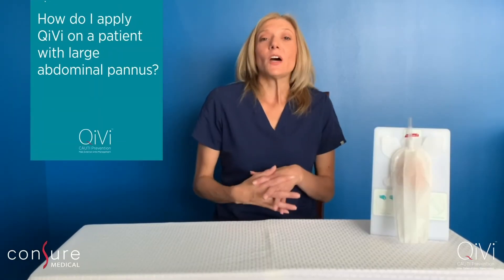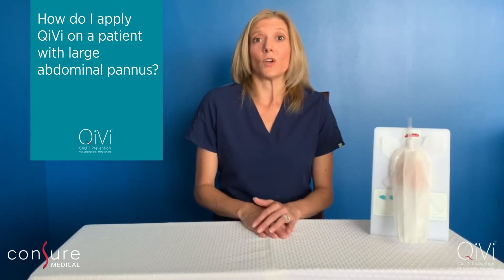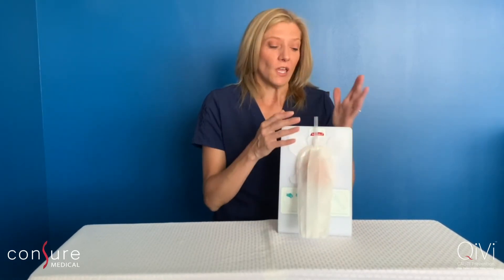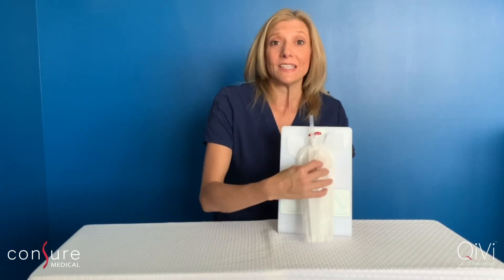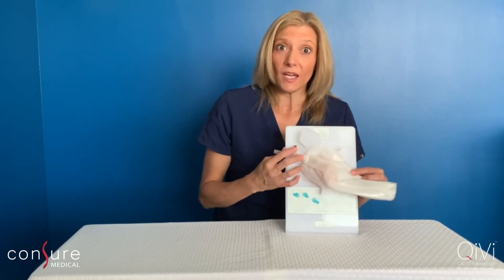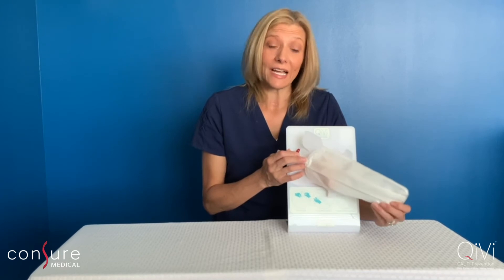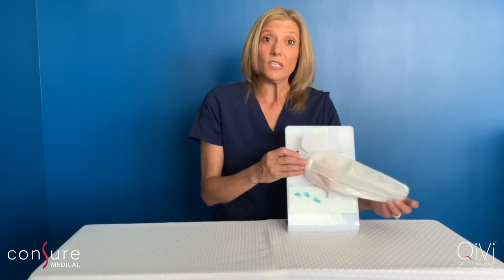Another question I get asked a lot is: how do I place QV on a patient with a high BMI or a large abdominal pannus? For patients with a large abdominal pannus, you just want to make sure that the pannus does not obscure the tubing. To do that, you may have to turn the device slightly perpendicular to either side, and that's okay. The device has tubing that runs bilaterally down both sides, so even if the device is on its lateral side, it'll still continue to suction up the urine from the patient and keep the patient dry.